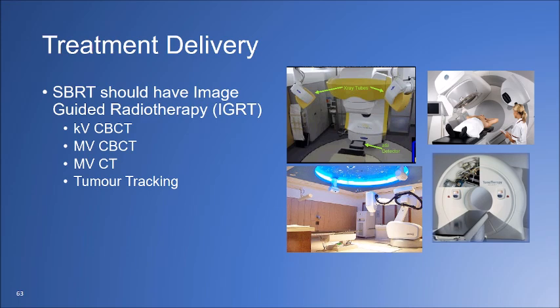They did a cone beam CT in the beginning, stopped halfway through the treatment, and at the end they had optical reflective markers, not surface scanning, to make sure that the patient doesn't move in between. After the treatment they also did CBCT and verified whether the position is correct. If you're using Tomo, you may have to go for an MVCT, or tumor tracking will be an option.